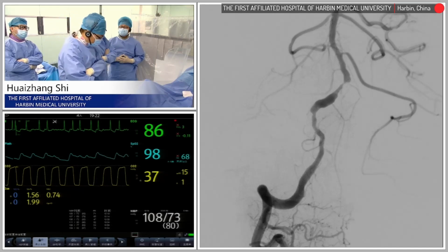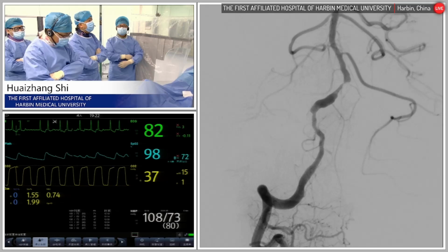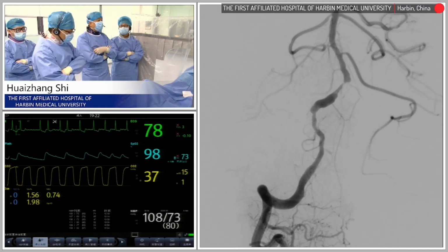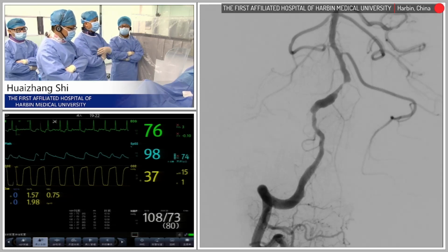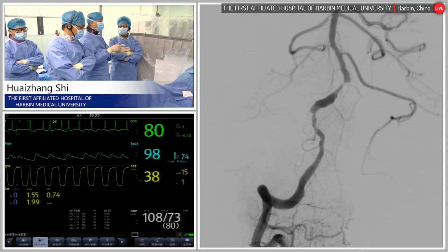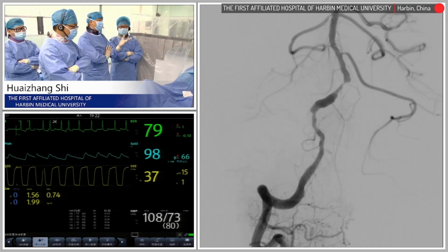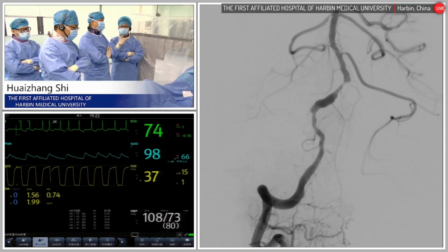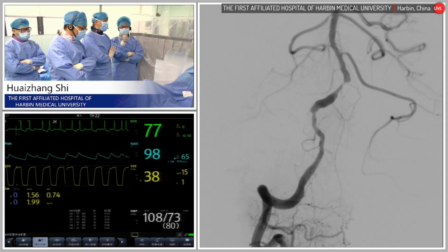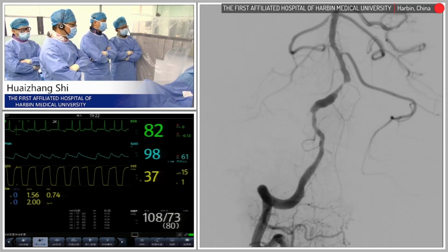Okay. As Professor Wu showed, the patient has both right and left vertebral stenosis. For such a case, we should focus on the dominant artery. In this case, the right one is the dominant artery, so our strategy should focus on the right one. For the right one, there are two lesions in the right vertebral artery.